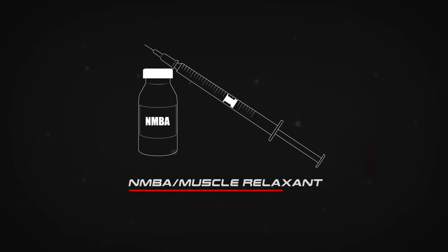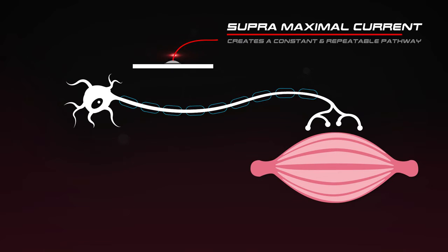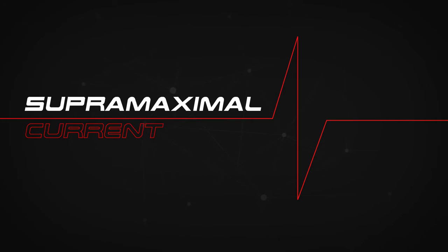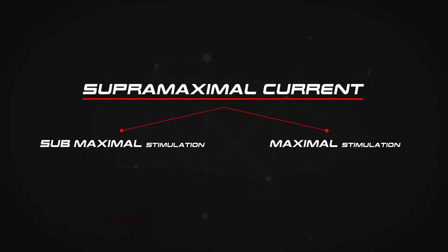In order to reliably make an assessment of the efficacy of the muscle relaxant, we need to create an environment where the first pathway is constant and repeatable. This is achieved by applying a supramaximal current to the nerve. What is a supramaximal current? Supramaximal current is best explained in the context of submaximal and maximal stimulation.